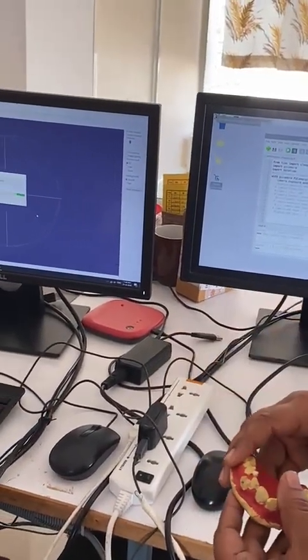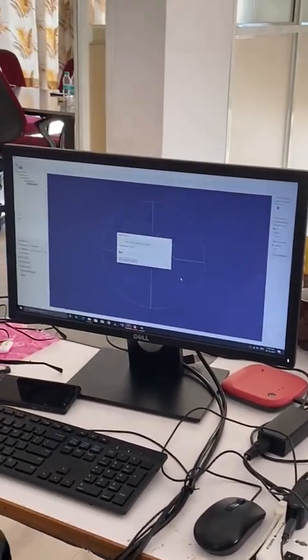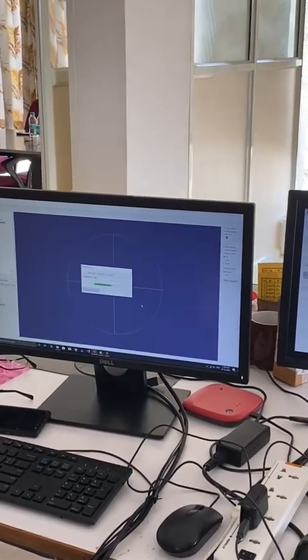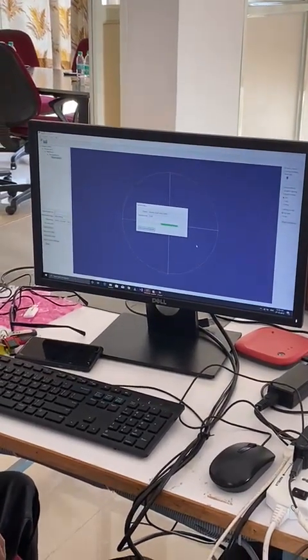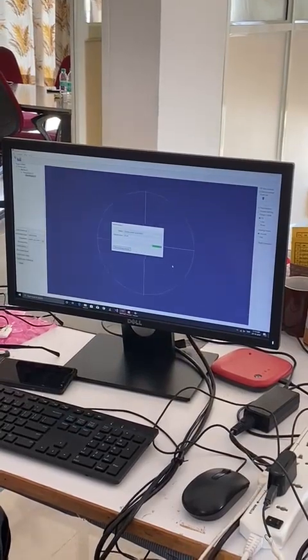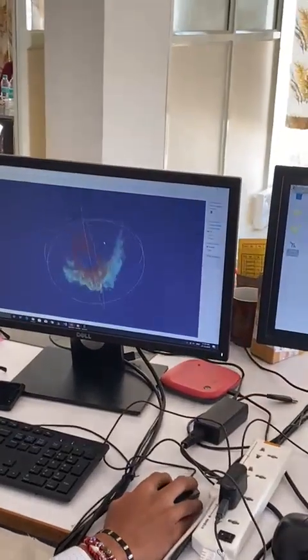What is the foolproofing system you have used? Like, it can take a peak when you are moving up and down, right? No. Any 2D image will generally be under a specific matrix. Any 2D image will have a specific surface area, and it will not go beyond that surface area. Whereas in 3D, you can always achieve multiple angles. Here it is specific. It will only be either 90 degrees, 45 degrees or 60 degrees. When you do a computation, the angle is set. Once the angle is set, it will start building on top of that. So you keep that assumption first, then you take measurements with reference to that point.